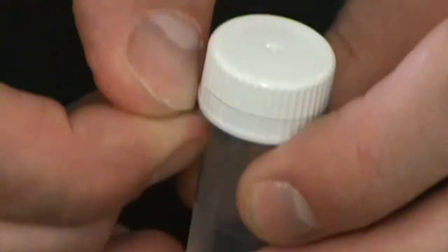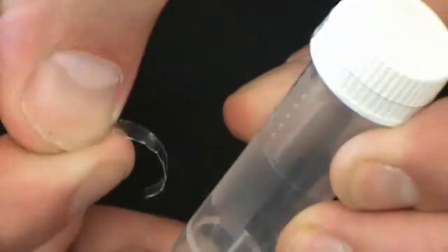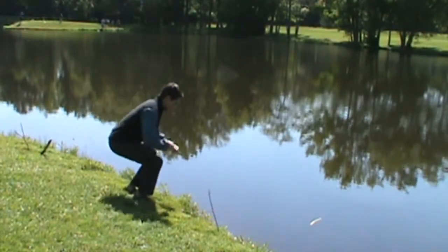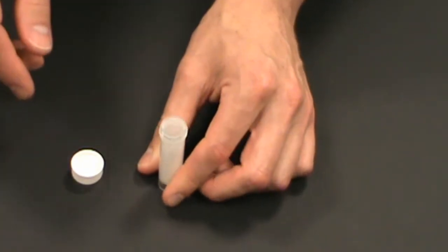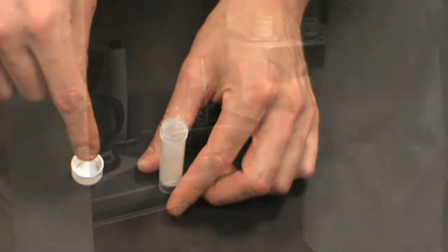Go ahead and remove the plastic seal from the lid. Before you remove the lid from your vial, go ahead and move to wherever it is that you plan to collect your sample. As a side note, when you do remove the lid from the vial, be sure not to touch the mouth of the vial or the inside of the lid. Now go ahead and remove the lid.